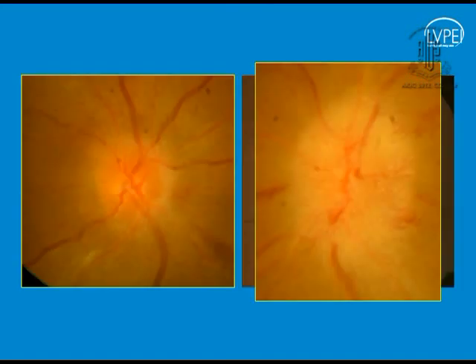Now this is another patient with benign intracranial hypertension, a little chronic papilledema, where we see long-standing exudates on the optic disc surface.